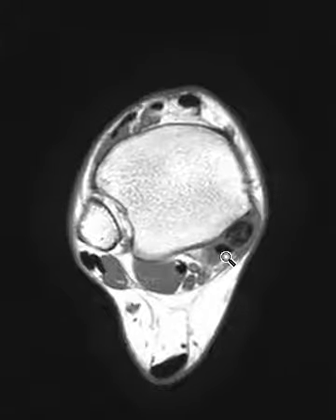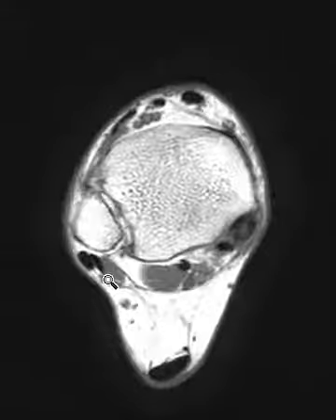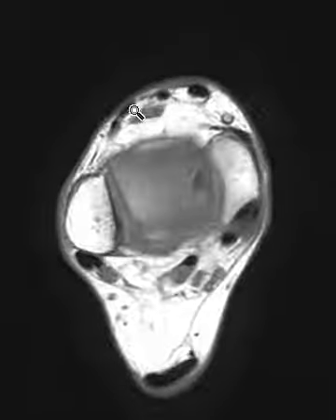And now here's the flexor digitorum, flexor hallucis here, looking completely normal. Laterally we have the peroneus tendons here, peroneus longus and brevis tendons, brevis in front, longus in back. And then we have the anterior tibial, extensor hallucis, extensor digitorum tendons here in the front.